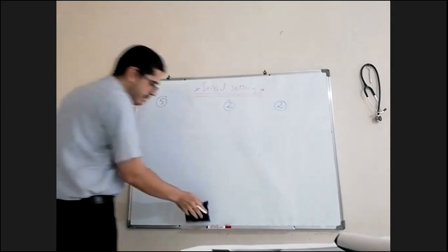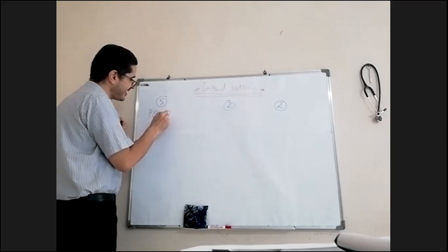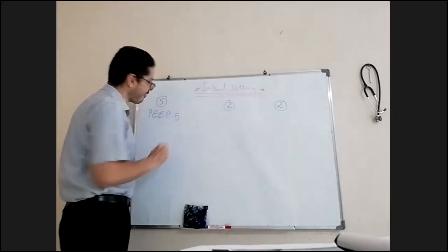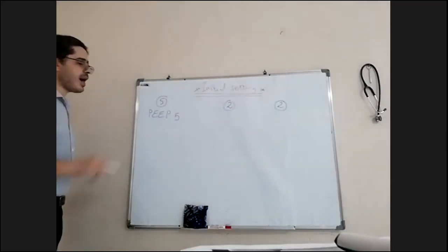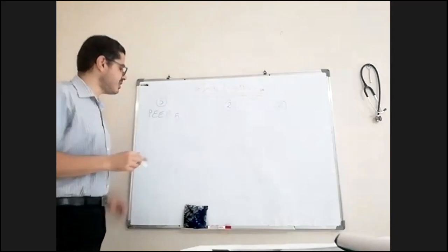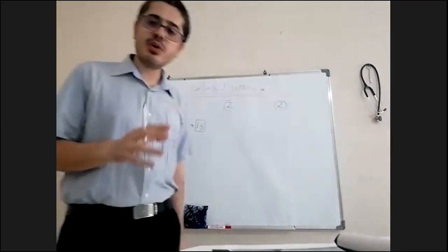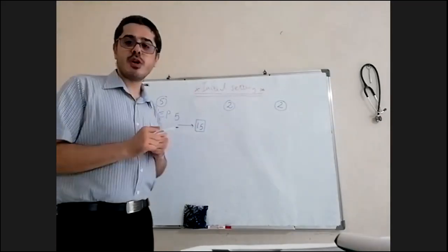Next is PEEP. I am sure all of you know what the usual PEEP is. Automatically, when you are on call and you want to put PEEP, all of you know the famous number 5. We start with 5. We can go higher in cases of ARDS. When we have a restrictive disease, we can go up to 15. In ARDS, you can go up to 15. PEEP is very good, like I said, for oxygenation, not for ventilation. PEEP is good for oxygenation.